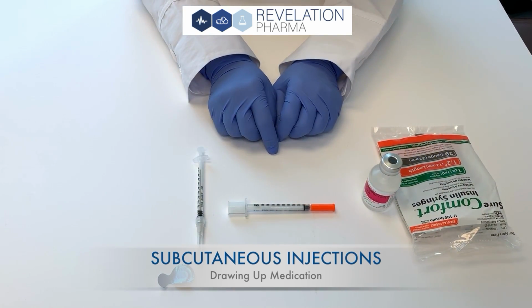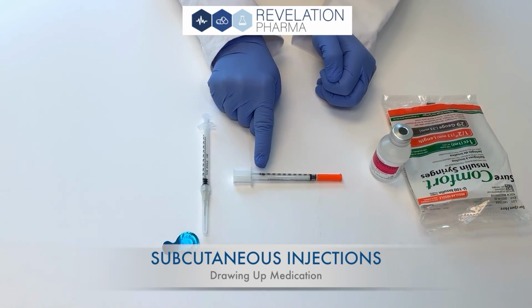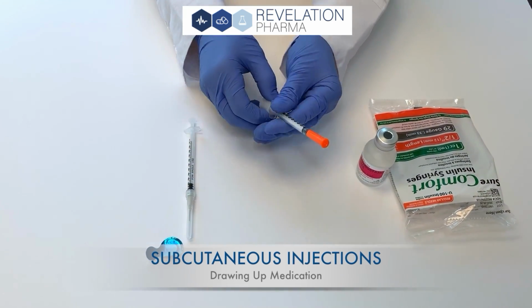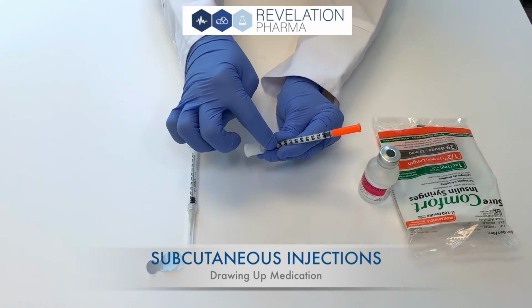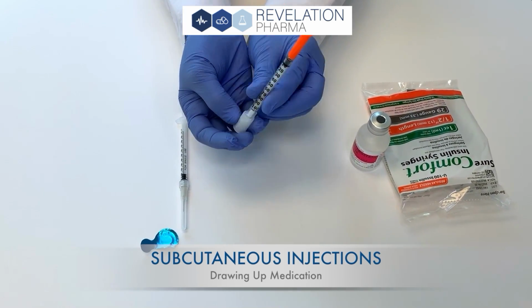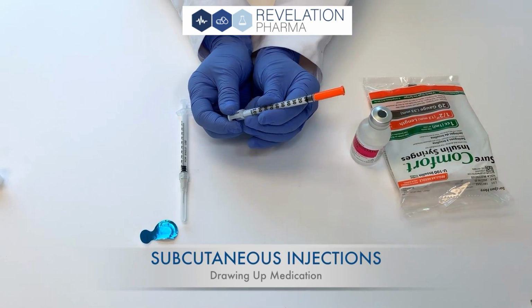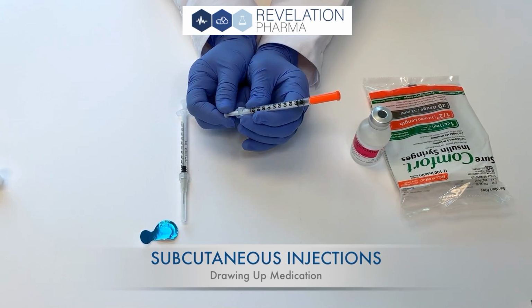The three parts of the syringe are the needle, the barrel, and the plunger. The needle goes into the skin, the barrel holds the medication and is marked in milliliters or units, and the plunger, you take this plastic cap off, the plunger moves the medication up and down the syringe.